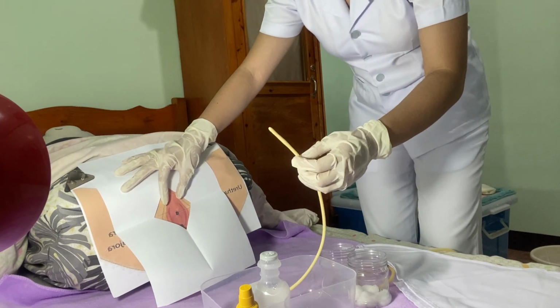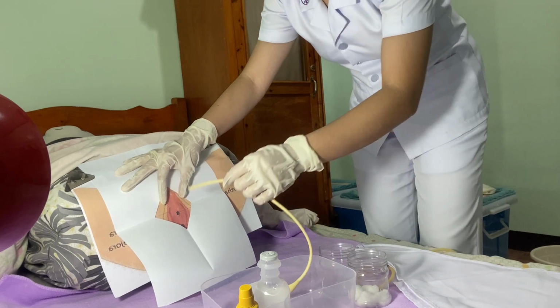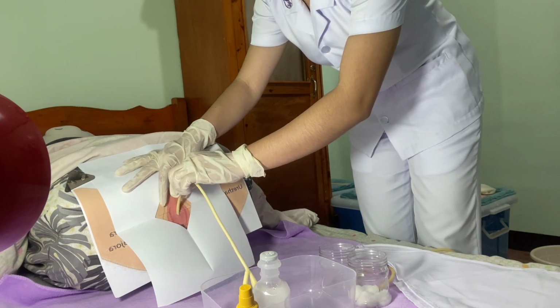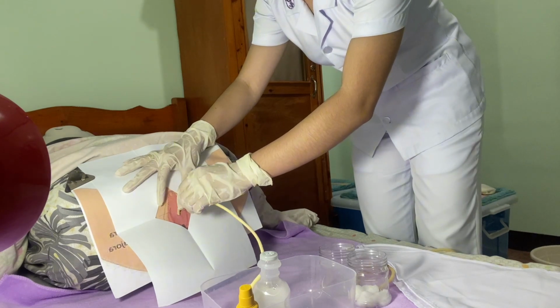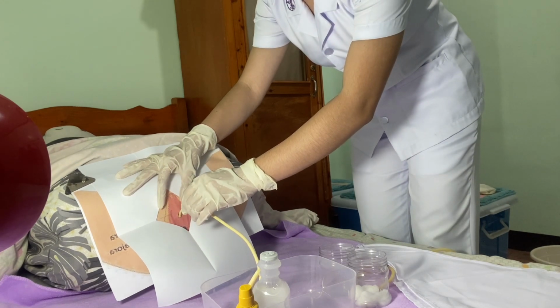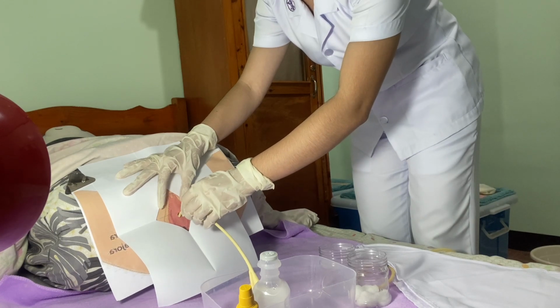So now I'm going to insert the urinary catheter. Ma, can you please just relax? So now I'm gonna insert the urinary catheter for about 2 to 3 inches, or until the urine flows out. The female urethra is about 1.5 to 2.5 inches. So relaxation of the external sphincter aids in an easy insertion of the catheter.